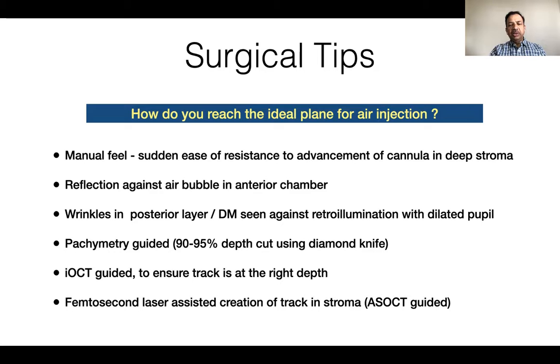If you use a diamond knife, you can make a cut depth of about 90-95% before introducing the cannula, so that makes sure that your cannula is at the right depth. If you have intraop OCT, you can use that as a guide to see whether your track is deep enough. Or in certain cases, you can use the femtosecond laser to make the track, OCT guided, for the introduction of the cannula.